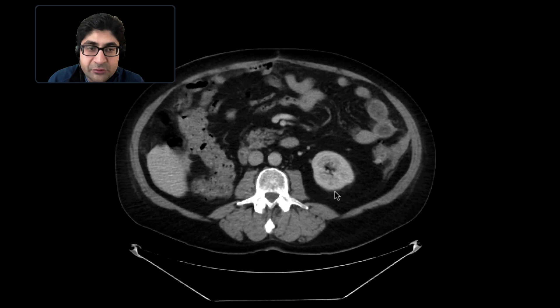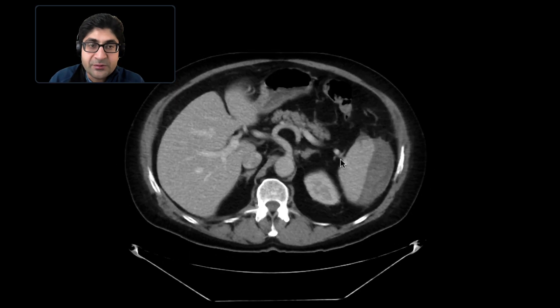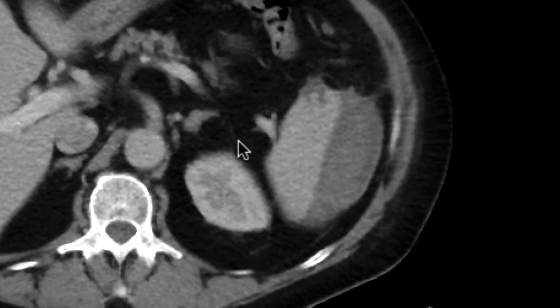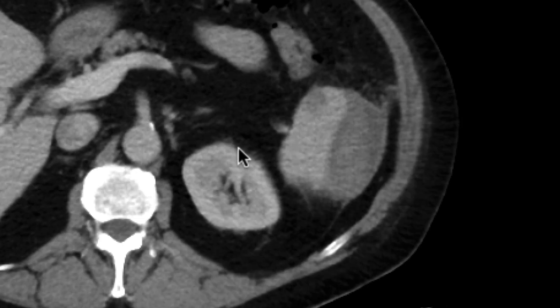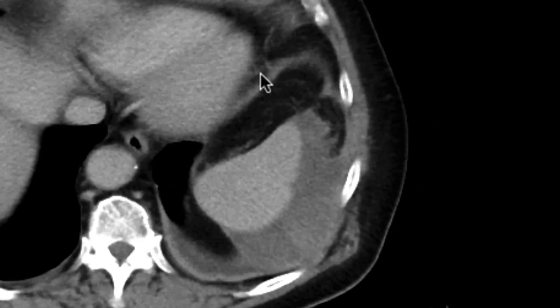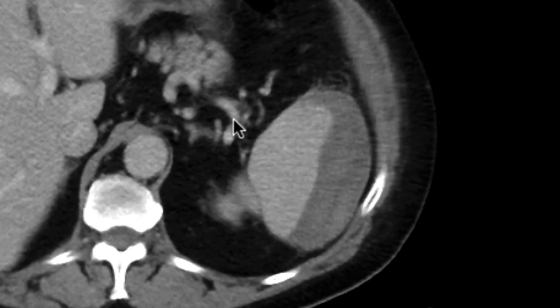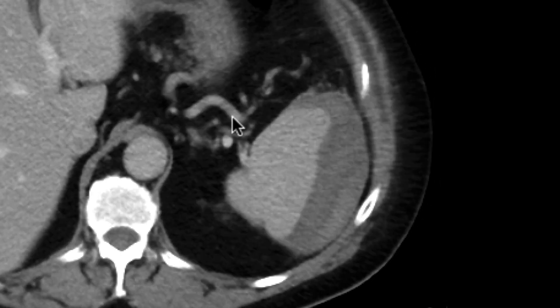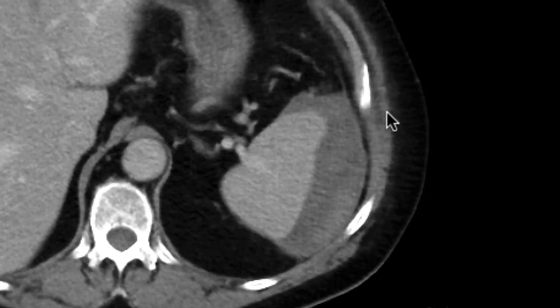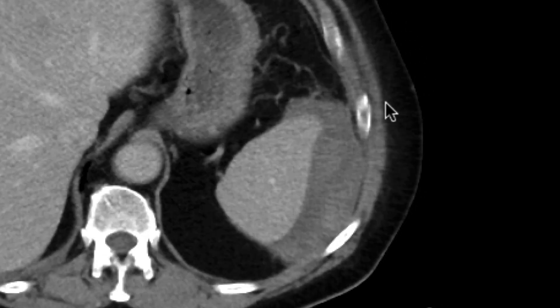However, when we do scroll through these images, we notice that there's some abnormality surrounding the spleen. Look at this abnormality — we can see predominantly there's some heterogeneous fluid that surrounds the spleen. It has content that's high in attenuation and content that's low in attenuation. So really, in that instance, we're worried about a hematoma surrounding the spleen.